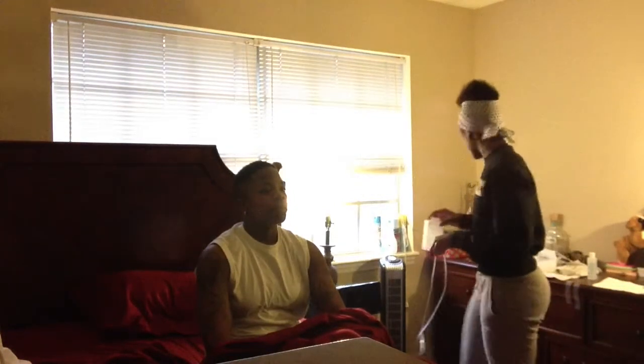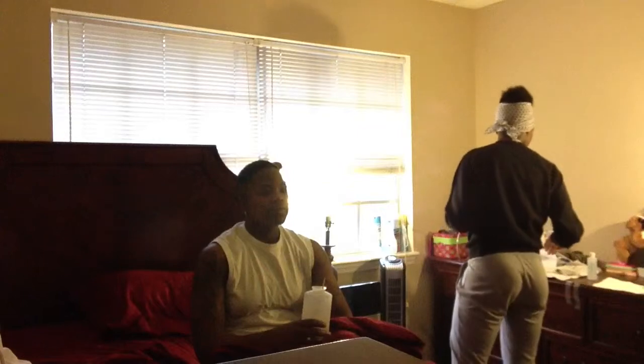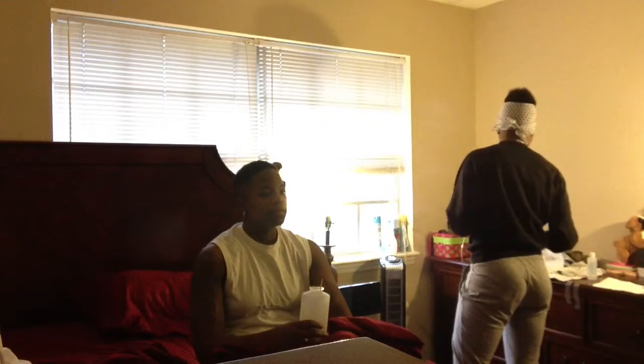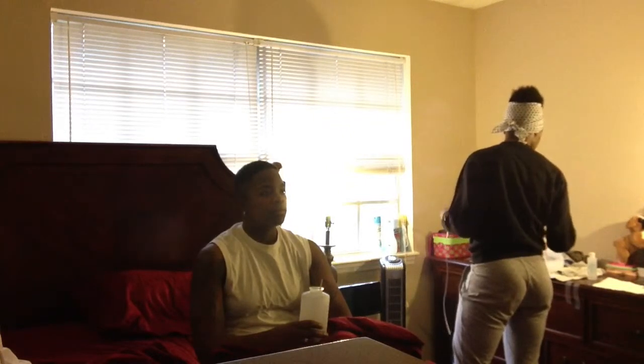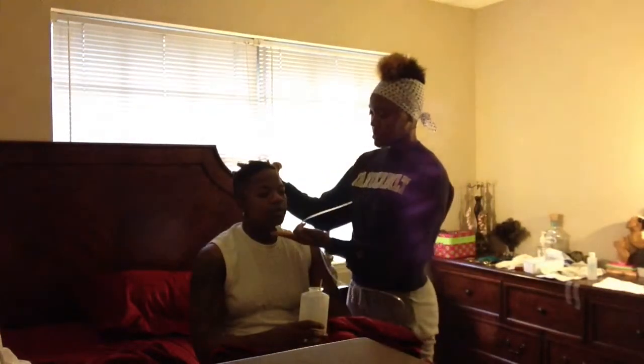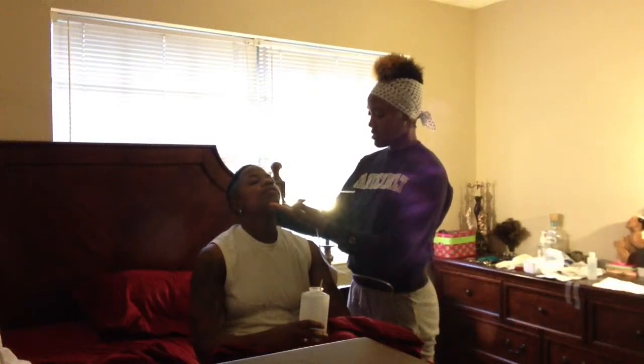I'm going to provide Ruby with water, which she's not going to drink yet, but I do want to have it available to her. And I'm also going to lubricate the tube with water-soluble lubricant. So once the tube is lubricated, I'm going to ask Ruby to hyperextend her neck.